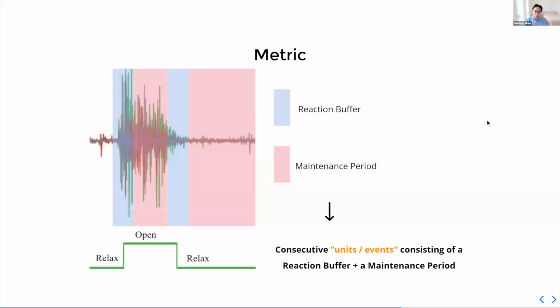Okay, so before we get into the results, I want to briefly talk about the metric we use to evaluate the models. And this is important because, as I just described, the inference behavior is actually quite different from the offline behaviors, right? So there is more to consider when you do online inference and when you use a device in an online setting. So we know the good behaviors. Can we quantify them such that we can evaluate them offline and compare across different models?